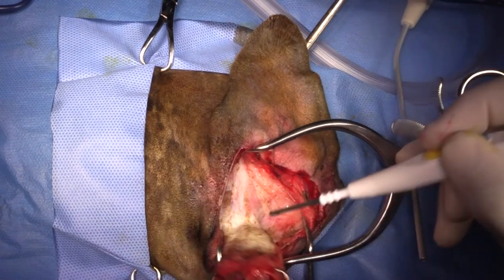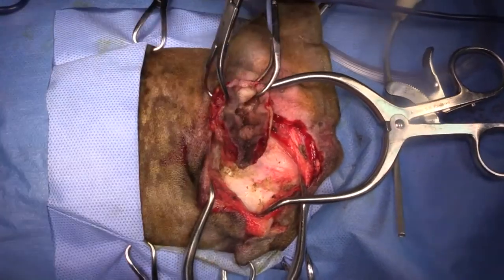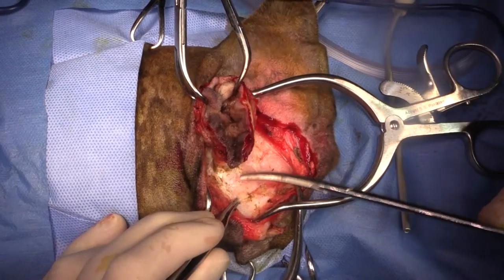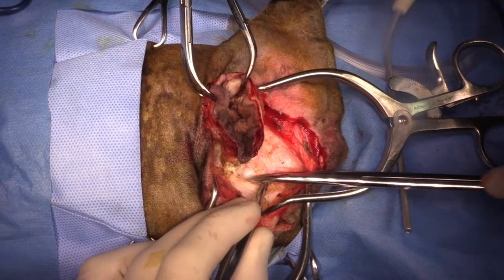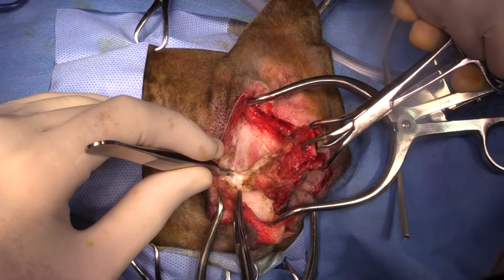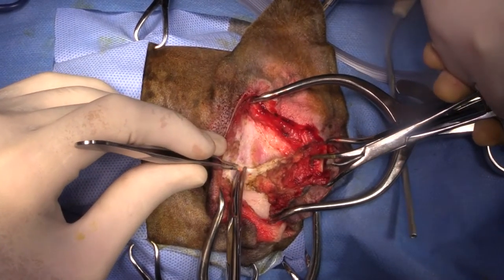Somebody asked if the bradycardia was caused by the acepromazine, but this dog was already bradycardic before we anesthetized it. This dog has a history of a reaction or complication with a previous anesthetic. I think it might have either sensitivity to opiates, which we think it does, but also possibly just an inherent bradycardia. I thought it had a third-degree heart block when I was looking at the ECG. It turned out that it was just a very severe sinus bradycardia.